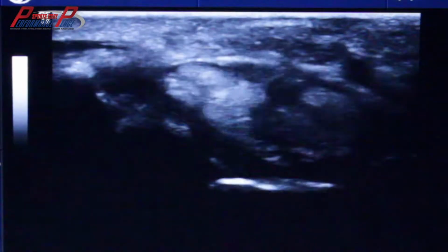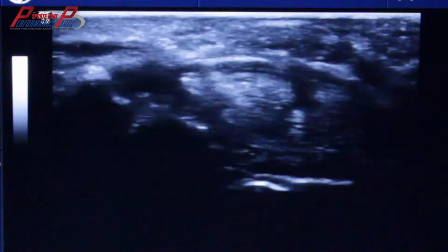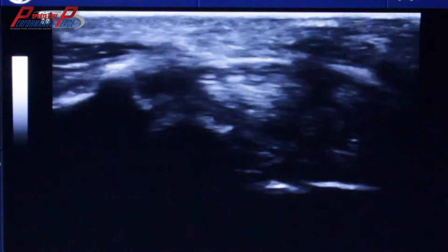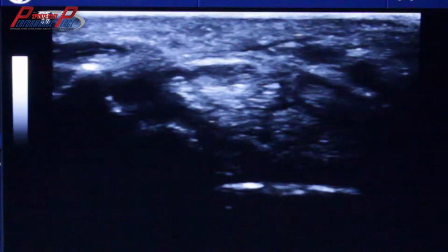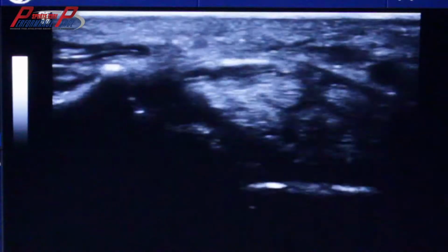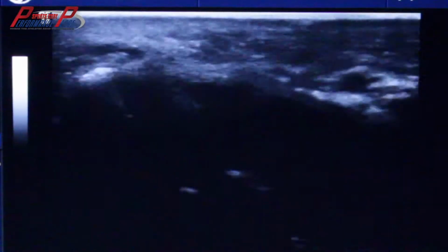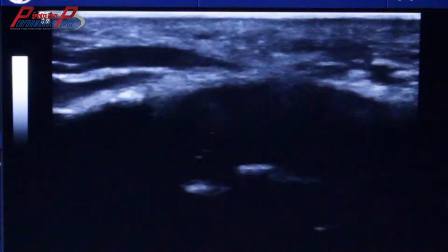So what we're going to use in this video is, we already know that the carpal tunnel can be a spot where compression of this nerve can happen, but I went to a seminar recently by Michael Shacklock for neurodynamics, and he showed a video of actually nerve movement within the tunnel from neck movement, which I thought was really interesting. So I have a diagnostic ultrasound, so I thought I would just come back and play with it and see if I can supply you guys with the same style video.